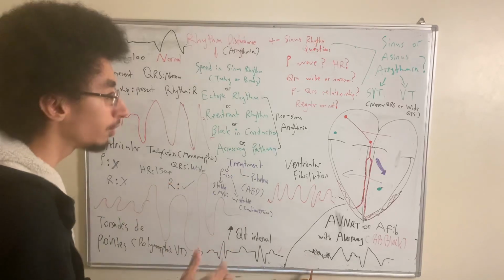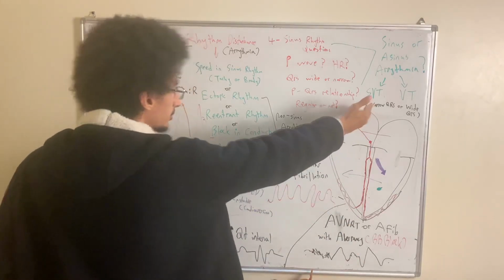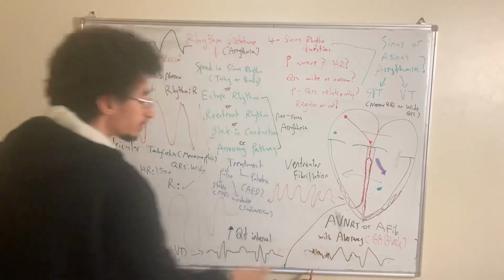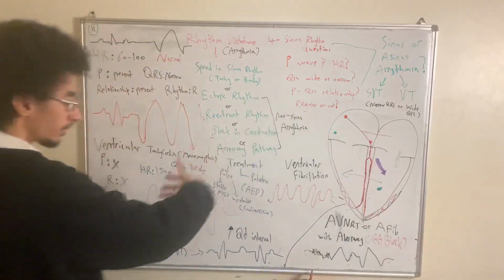But you should always be aware, in EKG, there are always exceptions, such as a supraventricular tachyarrhythmia with wide complex in the context of aberrancy. Aberrancy meaning the transfer of an abnormal action potential from an abnormal site to another.